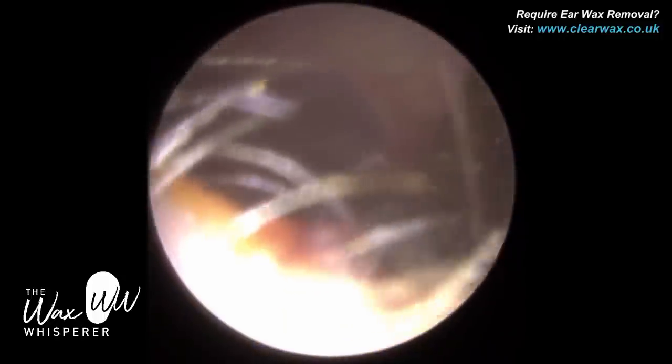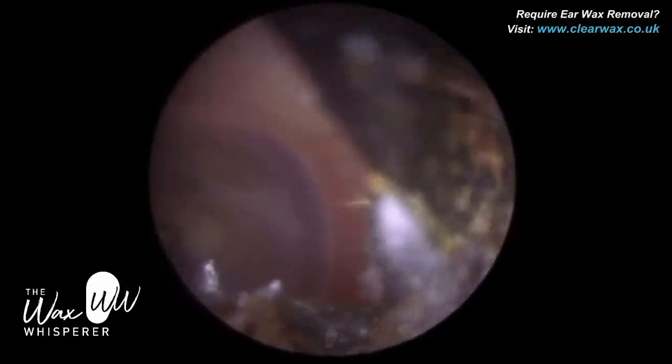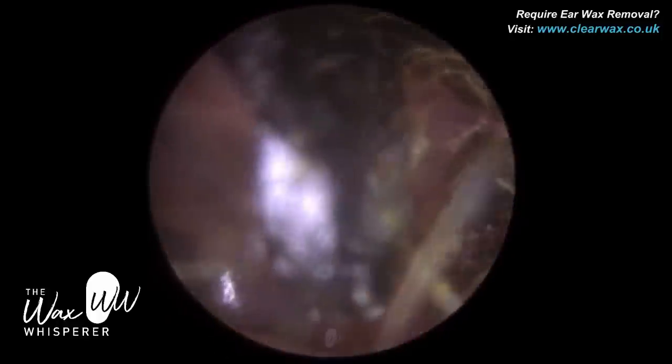When you perform microsuction, it can be quite noisy — it can peak over 120 decibels, which is extremely noisy. Similarly, if you have your ears irrigated with a mechanical pump, that can be quite noisy in the ear.